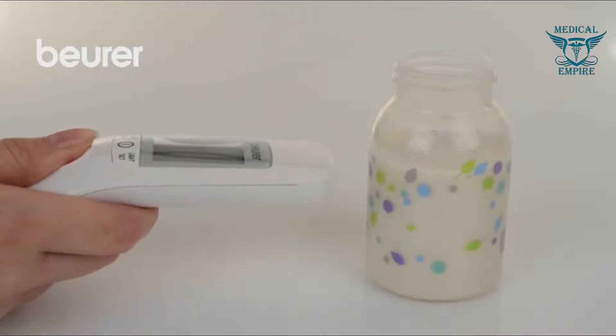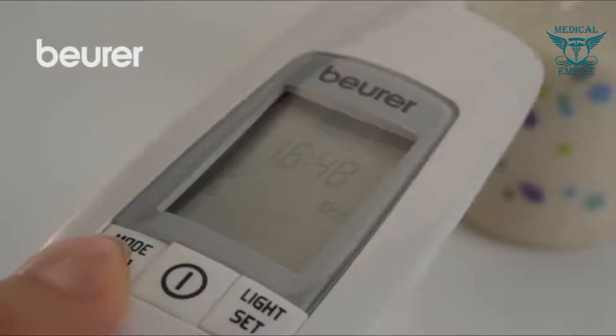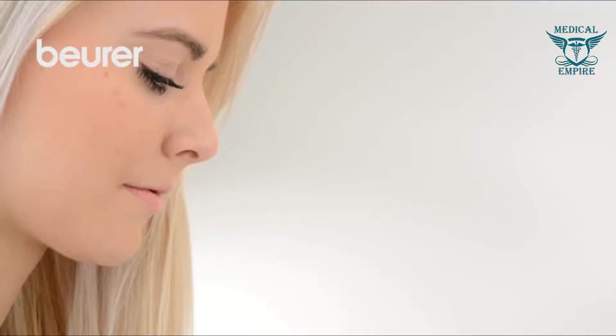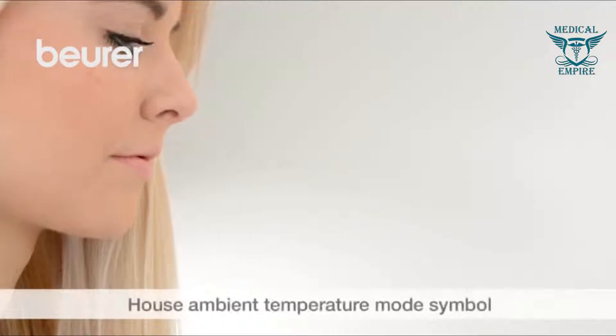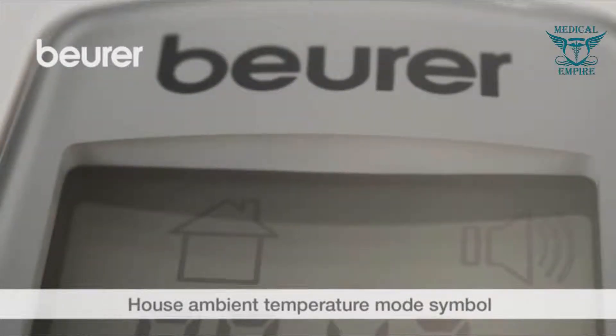Proceed as described above to measure object temperatures. Press the mode MEM button to change to the object temperature mode — the baby bottle symbol appears. The ambient temperature, indicated by the house symbol, is shown directly after having changed to this mode.